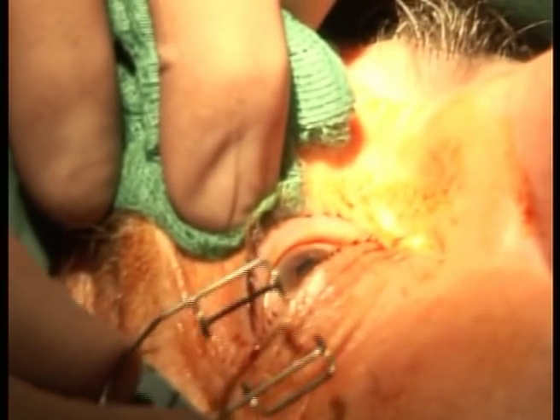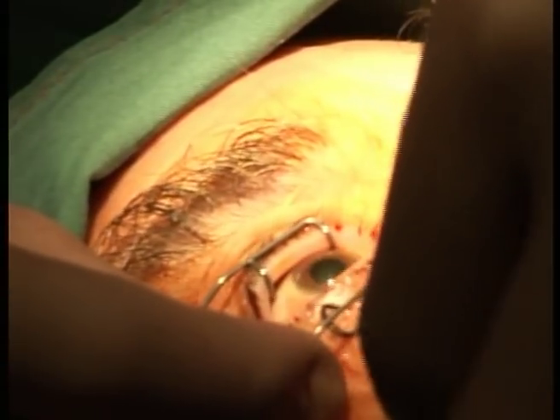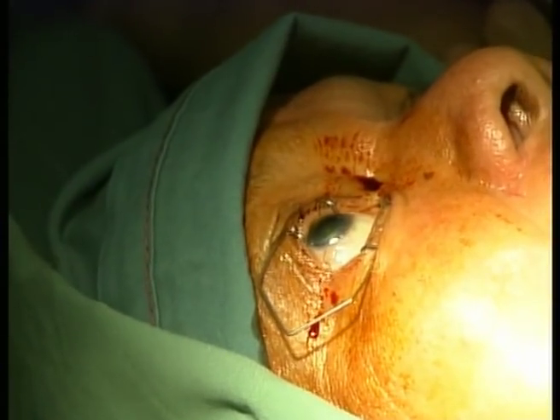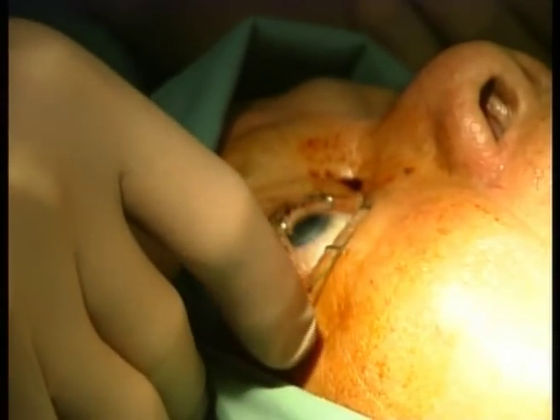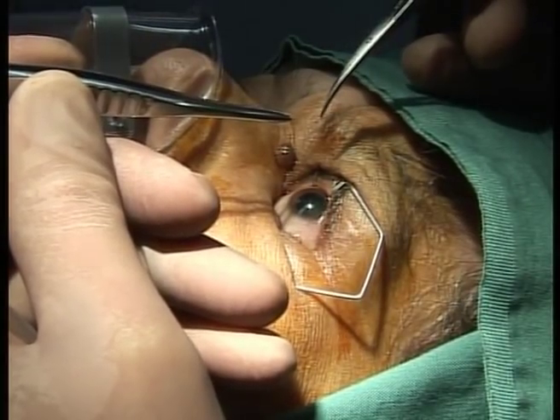Insert the speculum by asking the patient to look in the opposite direction to the lid under which you're about to insert the speculum. Don't press against the first lid when inserting the speculum under the second. Ask the patient to look up and out, and sometimes then rotating the speculum better exposes the infranasal quadrant. Have both hands resting on the patient to minimise any tremor. I prefer to sit.